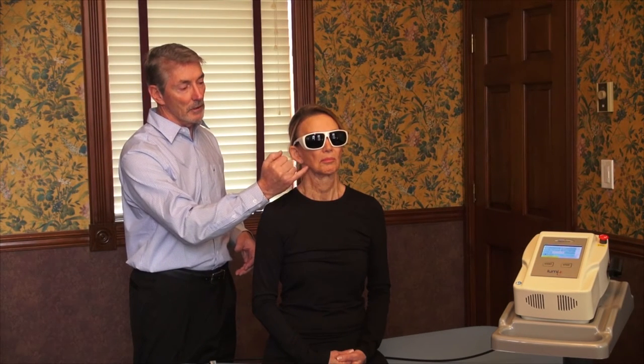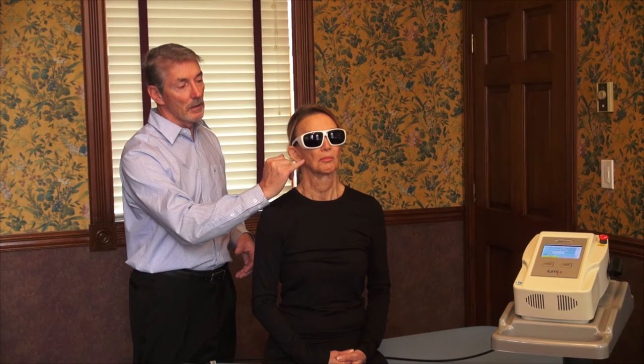If I have an abscess, it doesn't hurt to treat along the lymphatic line to get better drainage, or to use a broader beam — I will get better benefit through increased microcirculation in that area, increased overall tissue response, and broader local immunity. Supportive tissue interaction within a given area will all be enhanced and benefits are increased. That doesn't mean just shining a flashlight on the whole area, but don't be afraid to use a larger beam for smaller problems to get added benefit.